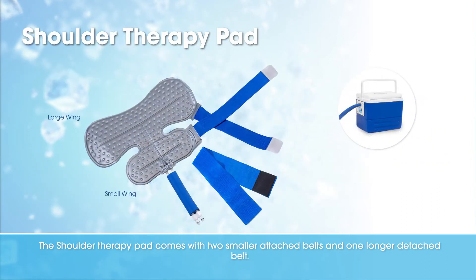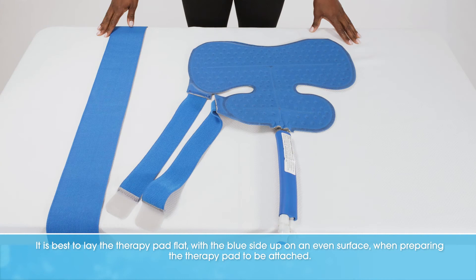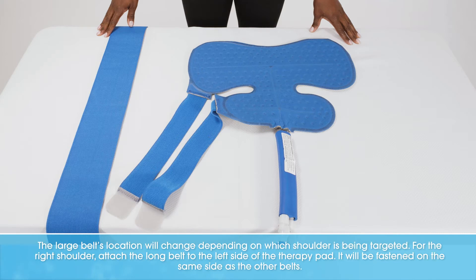The shoulder therapy pad comes with two smaller attached belts and one longer detached belt. It is best to lay the therapy pad flat with the blue side up on an even surface when preparing the therapy pad to be attached. The long belt's location will change depending on which shoulder is being targeted.